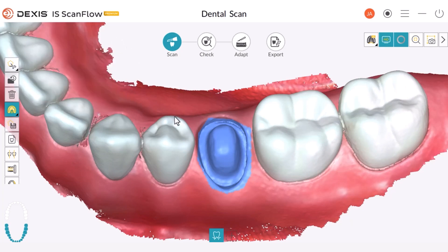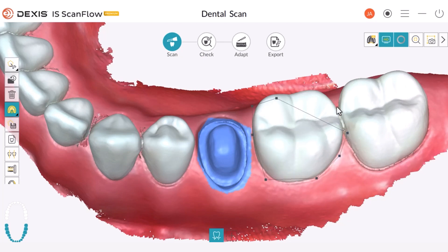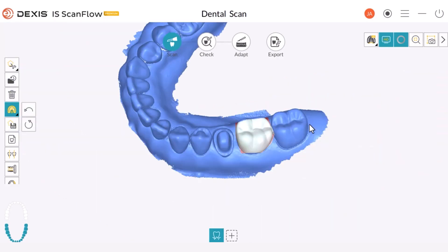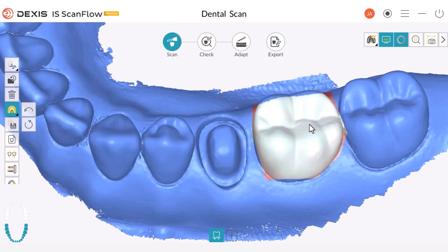Next, we are going to select the area that we want to keep by left clicking. Once the area is selected, double left click and everything else outside the selected area will turn blue. In this way, once we start scanning again, the software will only capture data on the area that maintains its natural color.